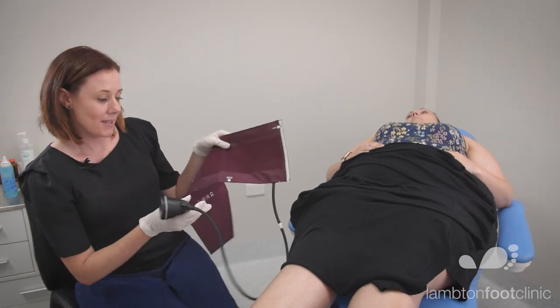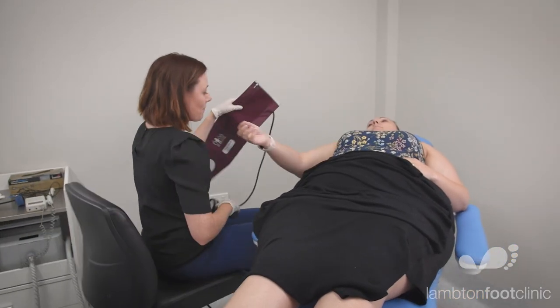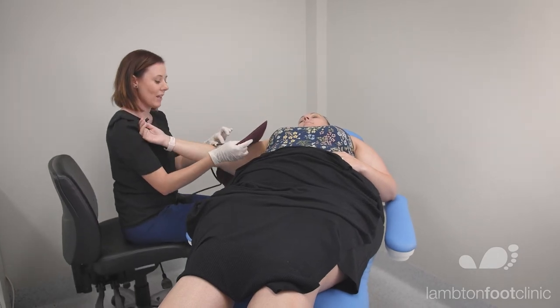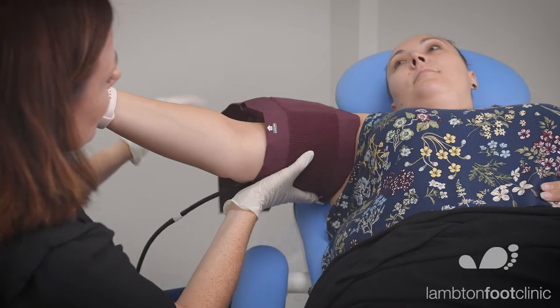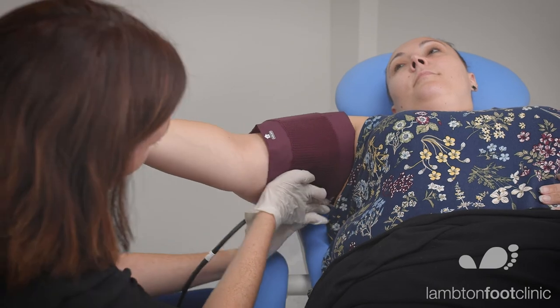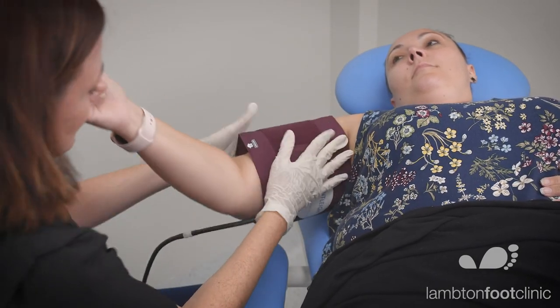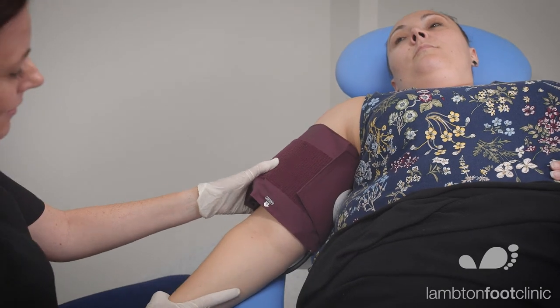So we use the brachial cuff and we place it around the arm. So I'll just get you to pop your arm out. We line up our artery line with the brachial artery and leaving enough space there for your Doppler probe to go in.